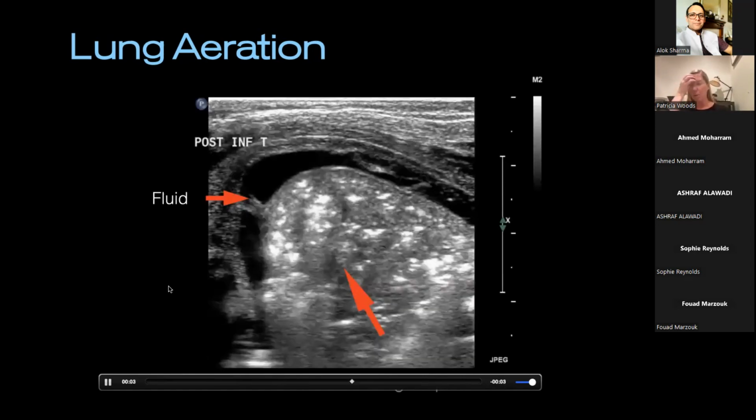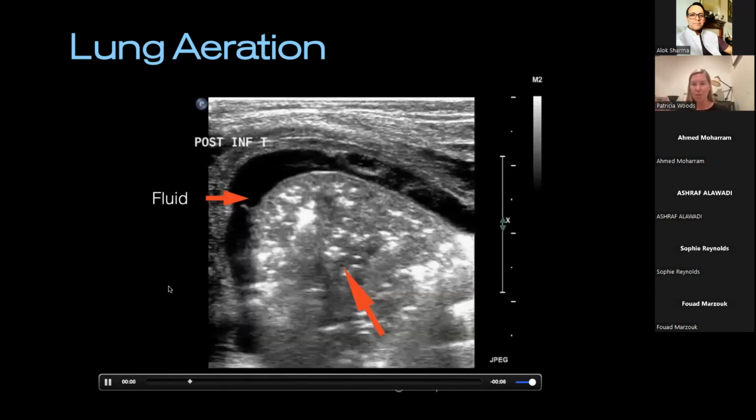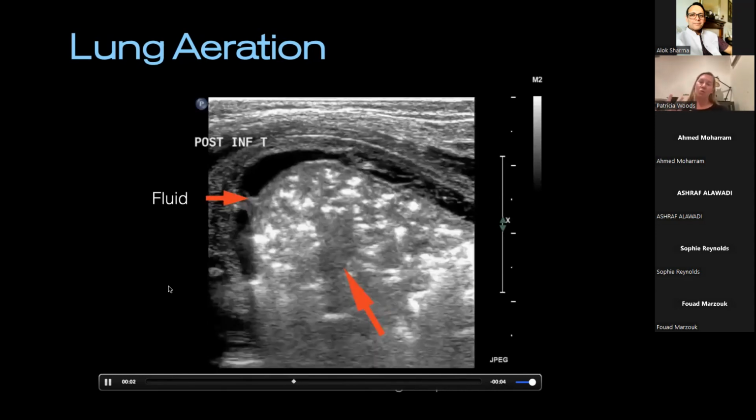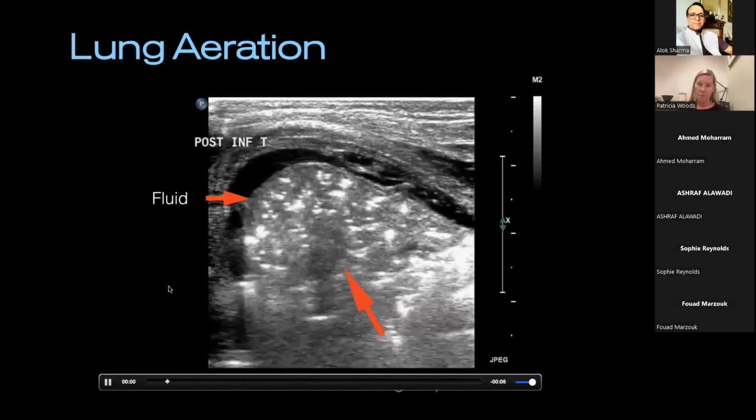And I think with the one we published, this one, we didn't even drain that fluid. We just changed the mean airway pressure and had a totally different recruitability to the lung underneath. So it's helpful in more ways than one.